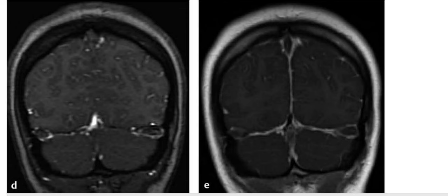Now these are the coronal 2D TOF MR image, and it is showing that there is iso to hypointense filling defects within the superior sagittal and bilateral transverse sinuses. There is minimal hyperintense flow. Minimal hyperintense flow can also be seen along the periphery of the filling defects.